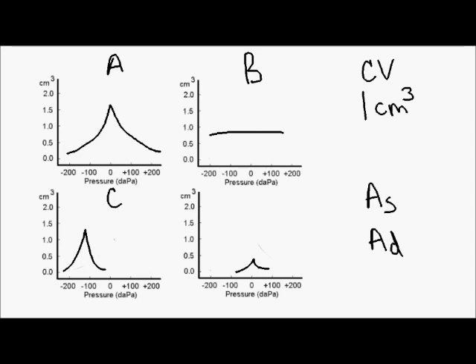AD, on the other hand, looks like this. And in this case, the D can be thought of as deep. The eardrum moves more than it should, sometimes even with the peak off the top of the page. This usually indicates ossicular chain discontinuity, which makes the eardrum floppy.